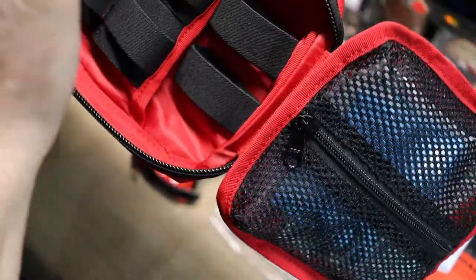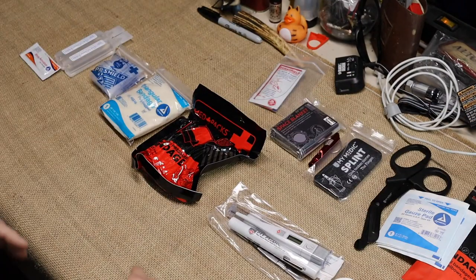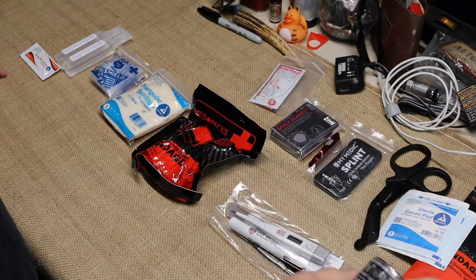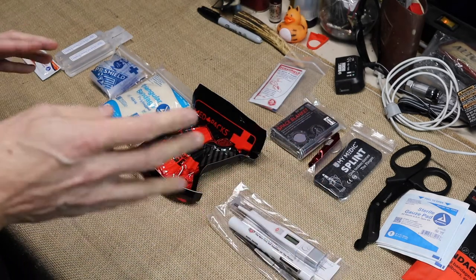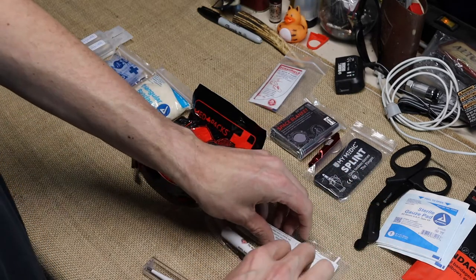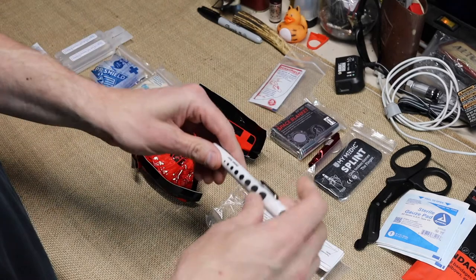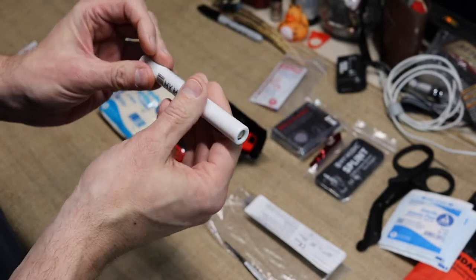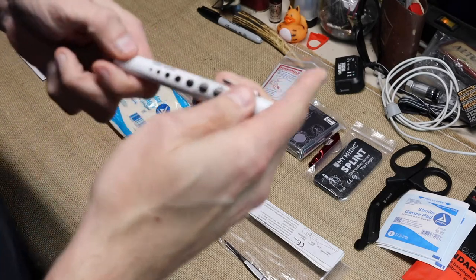Now we're going through the center pouch. You've got a normal compression bandage and normal surgical tape. This is where I was kind of blown away — you get a thermometer with disposable sleeves so you can throw them away after use. You also get a flashlight, a little pen light that's ready to go, and it has a pupil gauge on it.